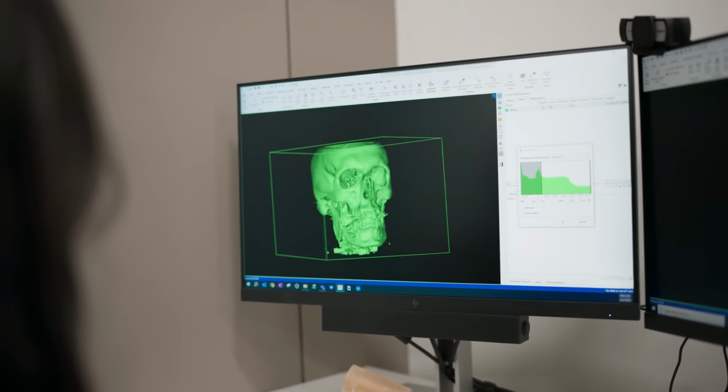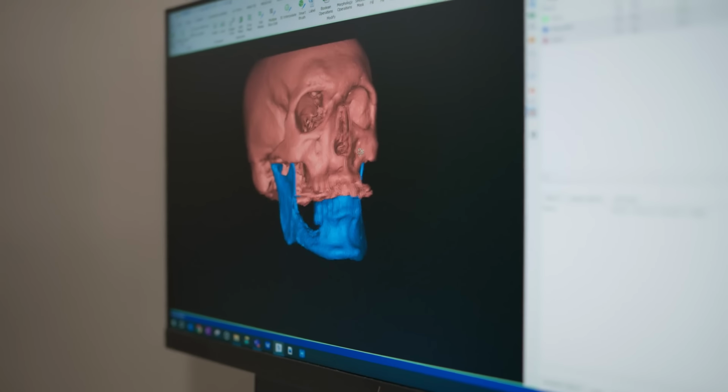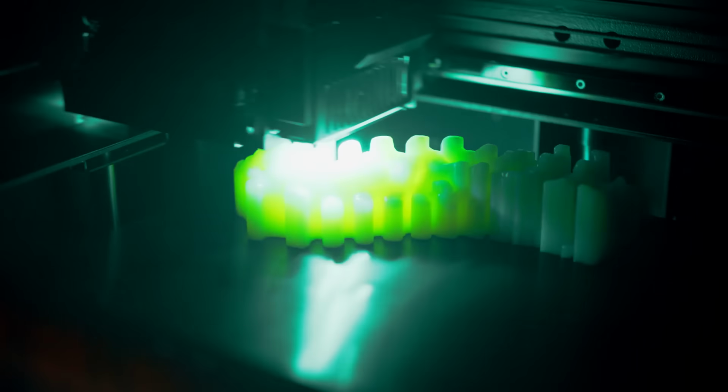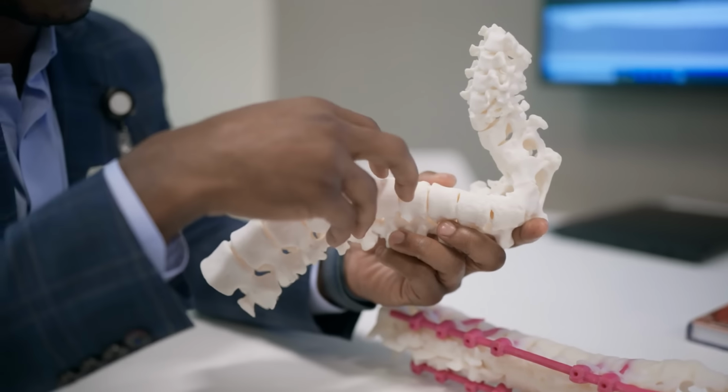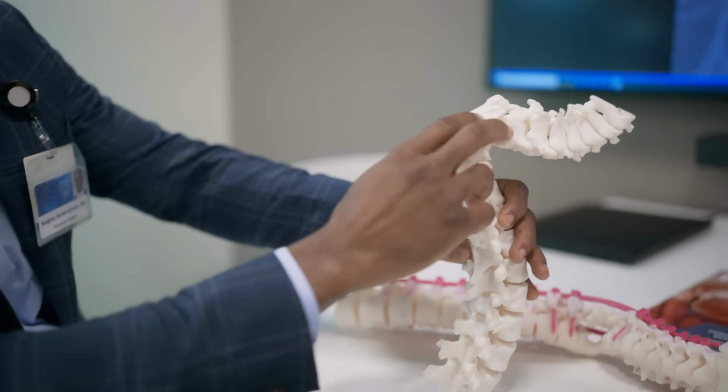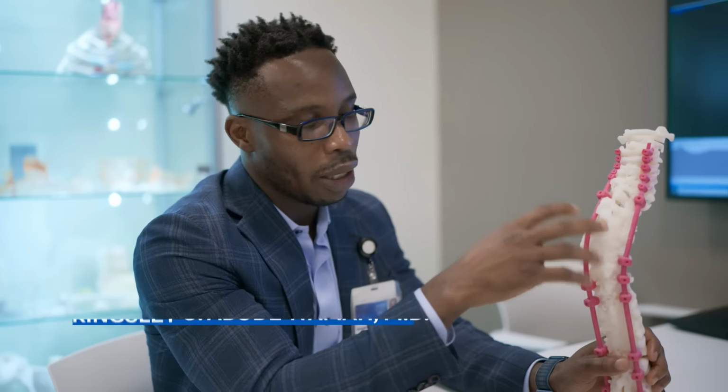This is an evolving technology. There are not very many places around the country doing this. You can see how severe the scoliosis is. This patient has previously undergone a fusion surgery, and so you can see this solid bone that has grown back here. Being able to look at things that we're not able to see just looking at traditional imaging gives you that comfort level to tackle more complex cases.